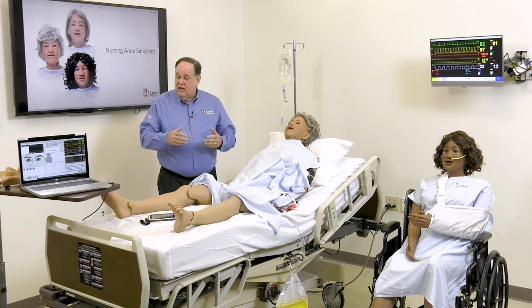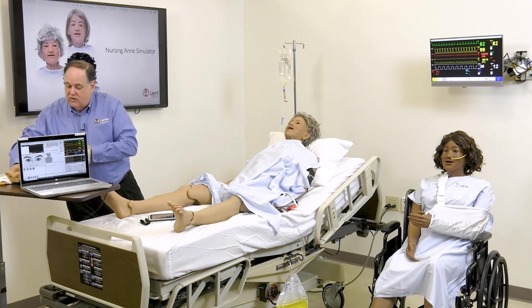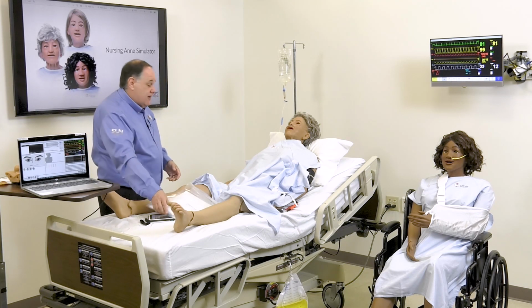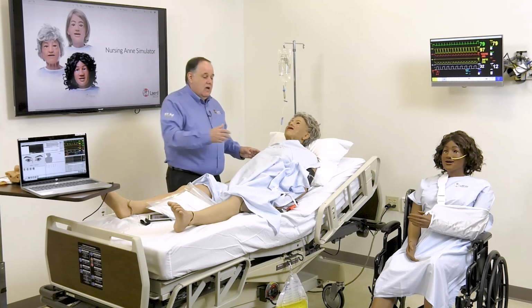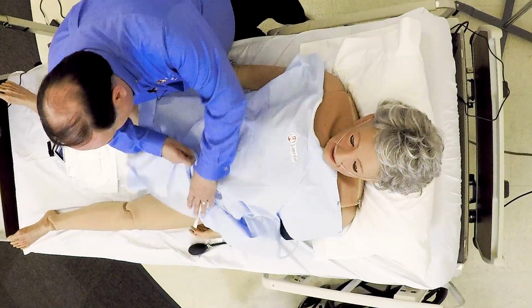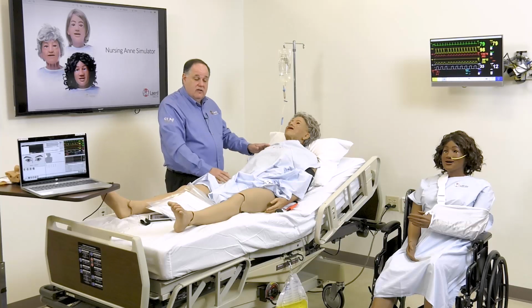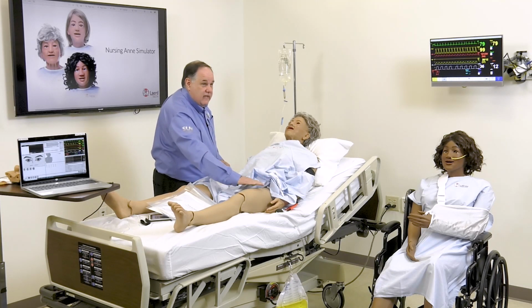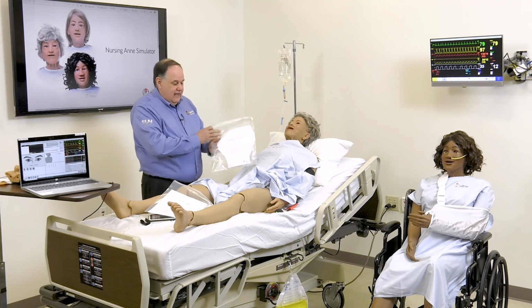Okay. So again, a few other little features that, before we leave, may be important to some of your disciplines is that she does have the ability for certain injections. She has injection sites throughout her body in the deltoid and on her sides here, so you can actually administer different medication and fluid. There are areas where you can administer fluid, and in her femur as well, you can do injections, but they have to be dry.